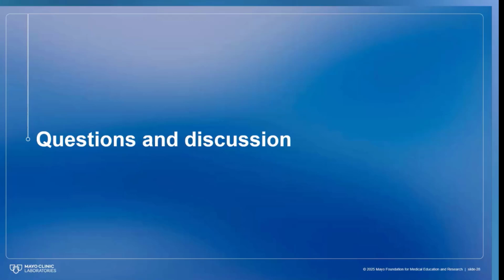Thank you. Next question is, digital scanning of cytology smears is challenging because of the 3D nature of smears. Does Mayo have a digital scanning approach to mitigate this? That's a good question. Cytology specimens are whole cells, so there are multiple planes. Traditionally for diagnostic purposes, cytology is always the last one to adopt digital scanning and digital sign out because of the Z-stack issue. That's exactly the question that we encounter every day.